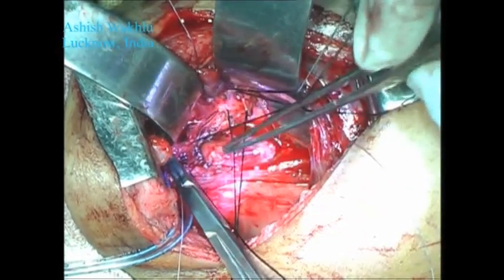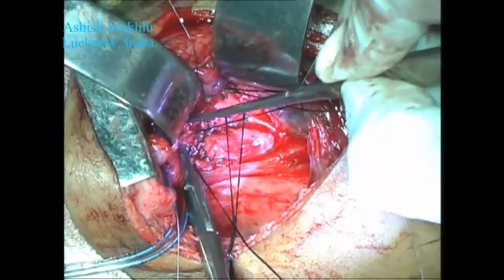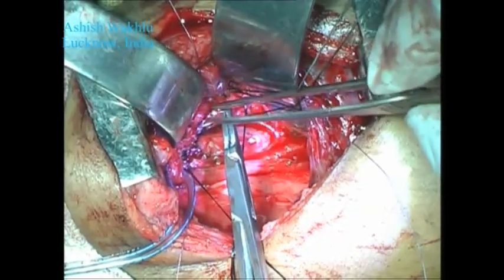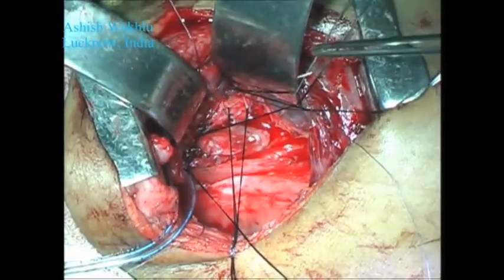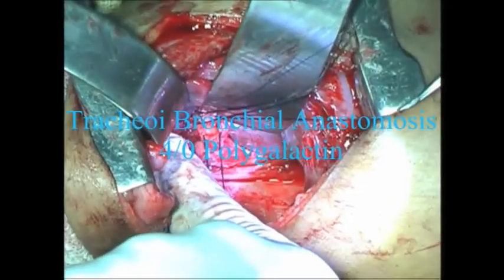We are now starting the anastomosis with the first vicryl suture in the posterior wall. This will go from inside out in the bronchus and outside in the posterior wall midline of the lung hilum.